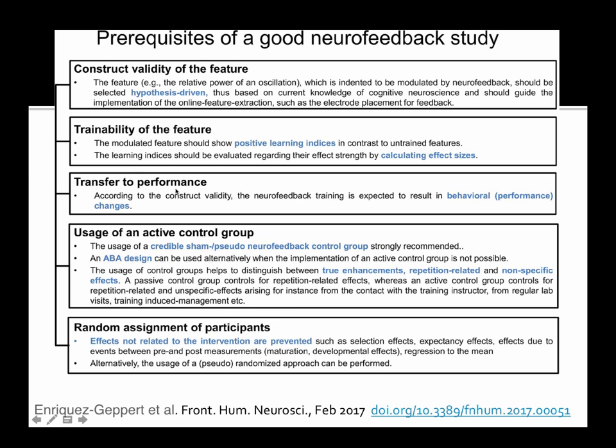And one of the features that is important is that we can transfer the performance. As I mentioned before, you will have a control, so you know where the subject was, do all your neurofeedback runs, and at the end, you would test again the subject in the initial condition and see whether there was an improvement. And in general, that is compared as well, ideally, with some behavioral performance. So not only that the brain activity changed, but, I don't know, if it was a motor task and I'm doing a pegboard moving pieces from one place to another, if my connectivity increased, did my speed increase, right?